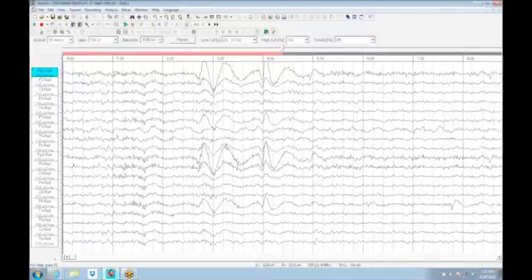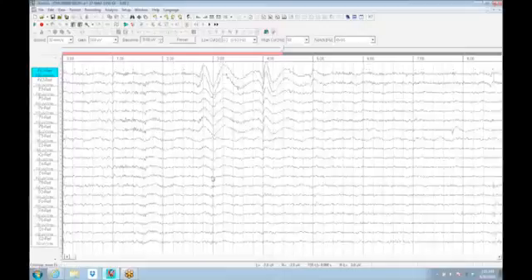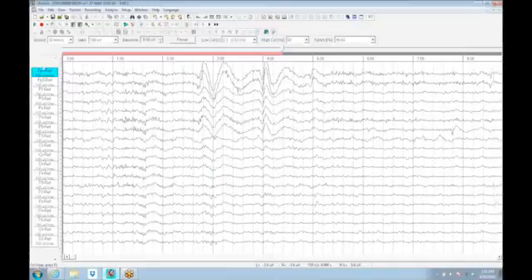I rescale it, turning down the sensitivity slightly, and we see eye movements out of the frontal areas. I'm going to switch the montage to one of the reference database montages, which basically is left to right frontal, left to right temporal, left to right posterior temporal parietal, and left to right occipital. And usually left right is an American convention.